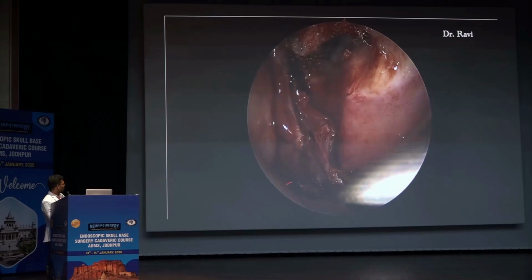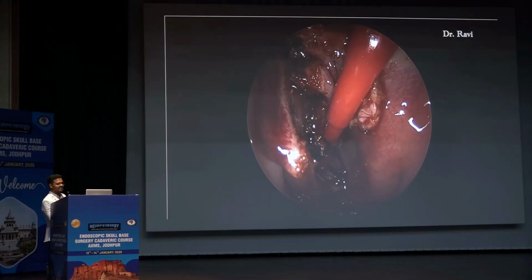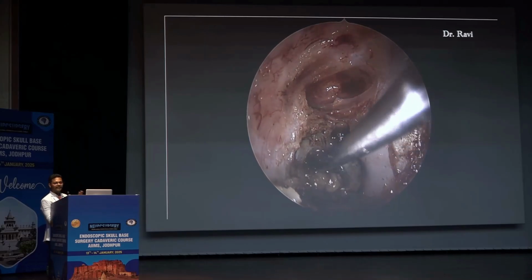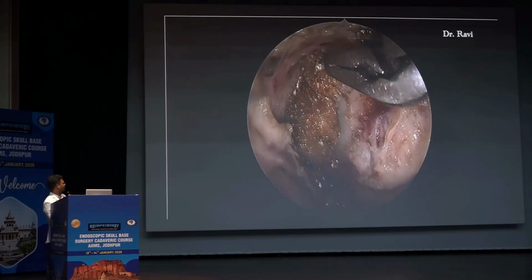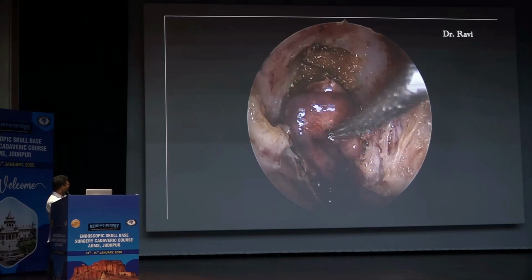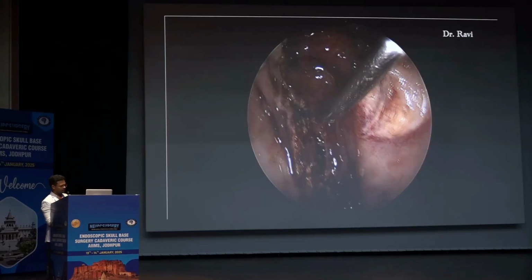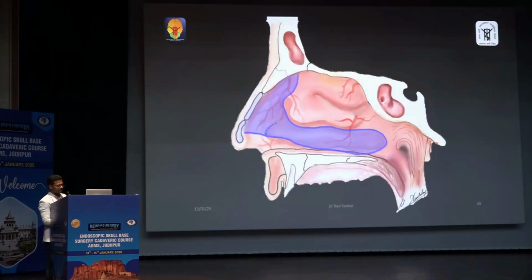It was very small. So here I made an incision on the third part. This is based on the second portion of the middle turbinate, so it is not arterial based. Here it is a random based flap, but it is comparatively better than the free mucosal flap because it has some attachment with the second portion of the middle turbinate. So again, multilayer closure, the fat, and then this is a piece of cartilage along with the mucosa still attached to the basal lamella. The child recovered very well, and the follow-up MRI showed very good take-up of this flap.